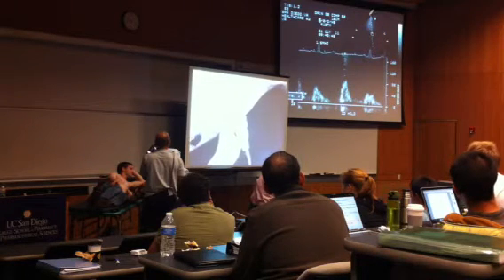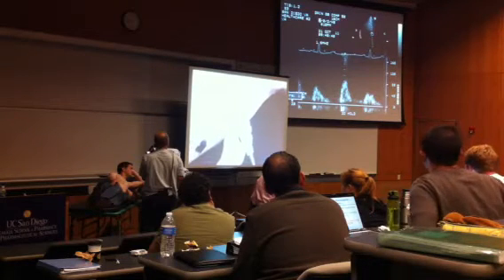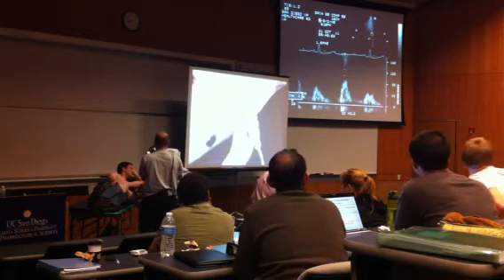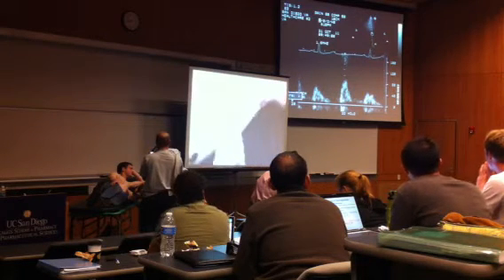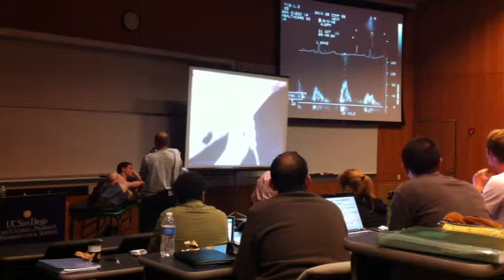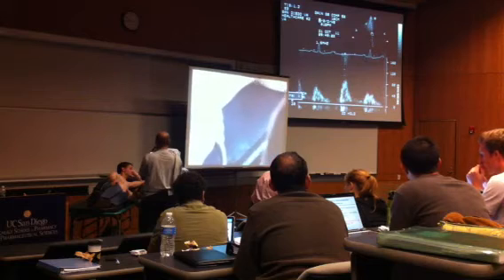So here's the apex of the heart. You can't see it, but my magic eyes can. The mitral valve is right where I'm showing you the green cursor there. The Doppler cursor is picking up flow below it. So the flow of blood is going in diastole from the left atrium into and filling the left ventricle.